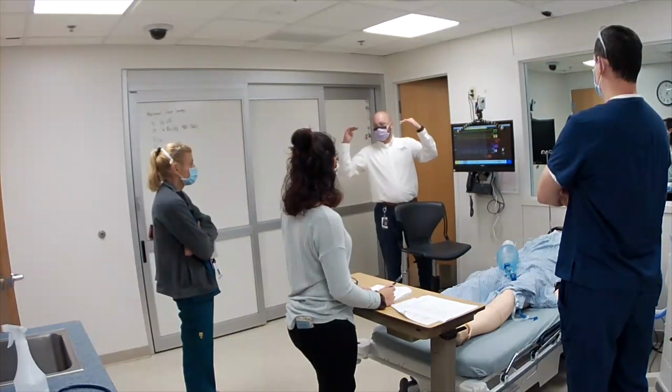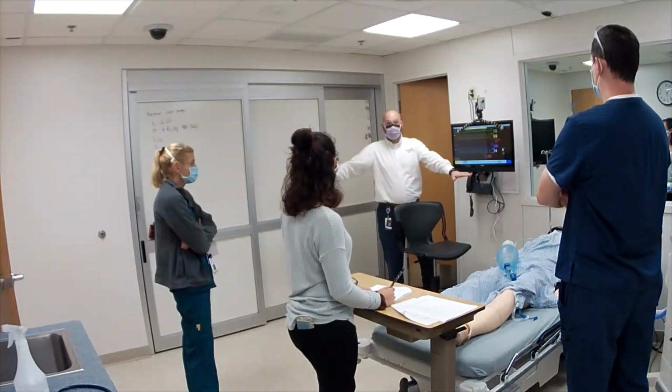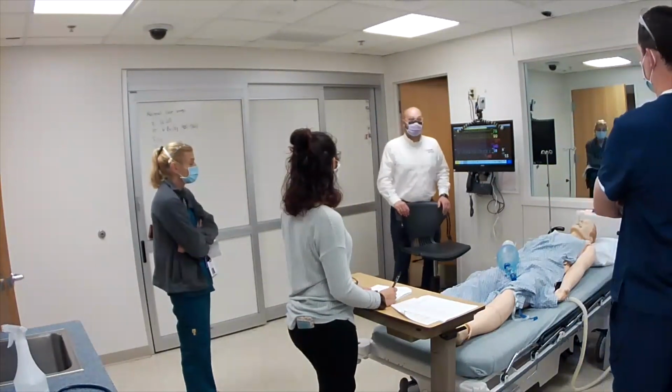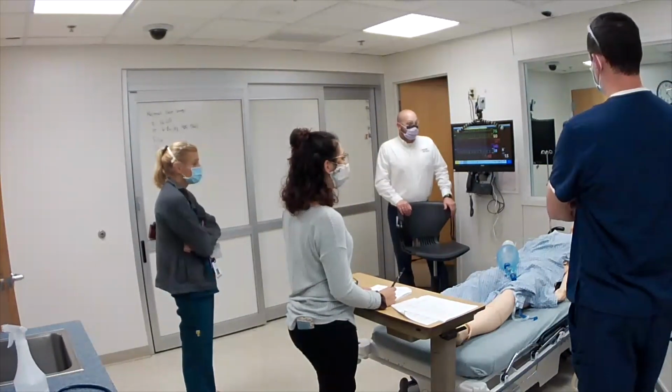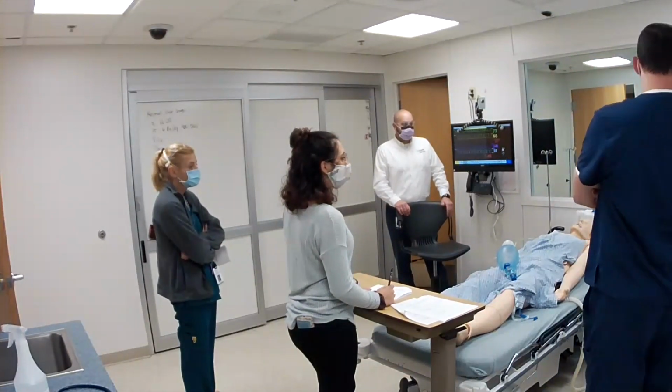What's next? Respiratory rate, the actual measured. Okay, we set that too, right? Right, but you could breathe over top of that. But in this case, Stanley's not, right? It's about the same. So he's not breathing over top of that. Okay, that makes sense to me.